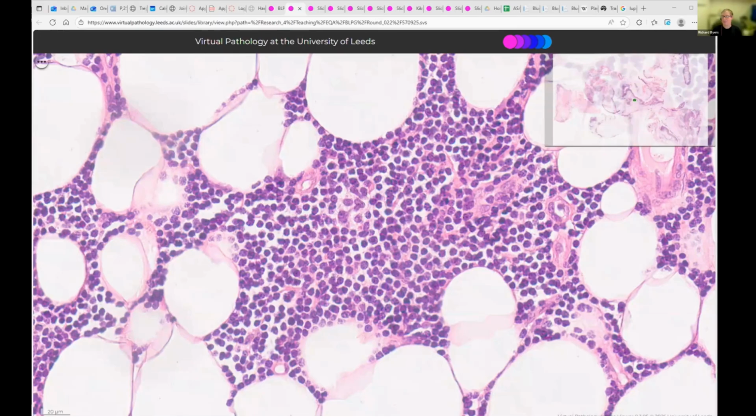Okay, not able to access my, that's fine. Right. So when you see small little cells like this, which are all very regular and all look the same, largely, whether they look like footballs or slightly condensed chromatin. So dense chromatin, and they're all small, then CLL is a very strong possibility. The other thing it could be is mantle cell lymphoma.